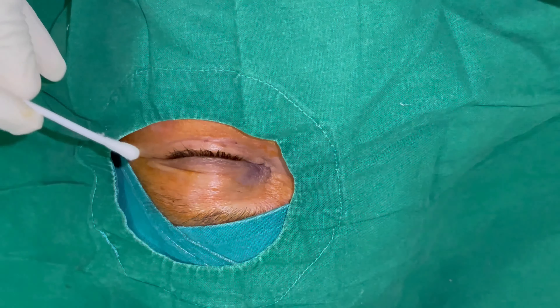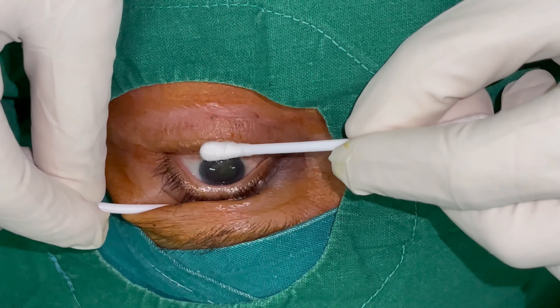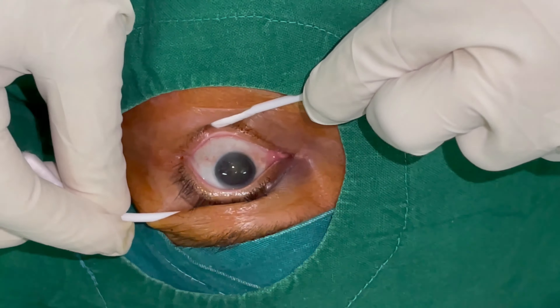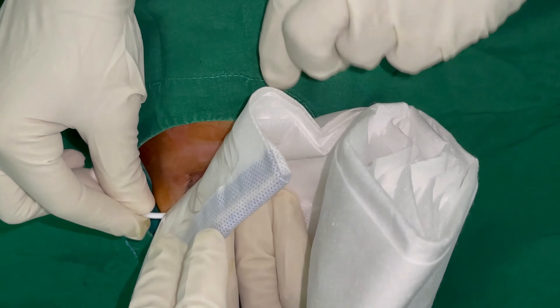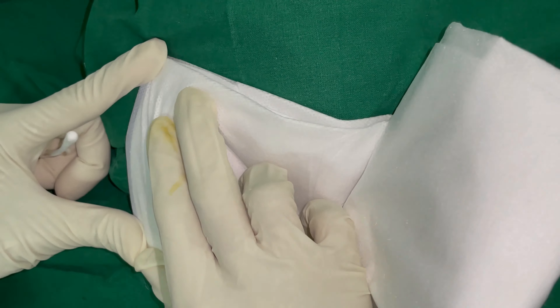We'll use two cotton buds to open up the eye and to keep the lashes away from the operating field, while the person adhering the drape sticks it firmly onto the eye in the manner just depicted. We now proceed with opening up the drape.